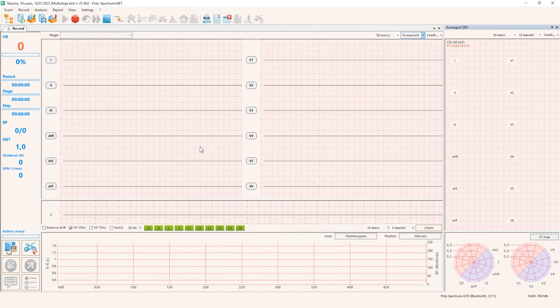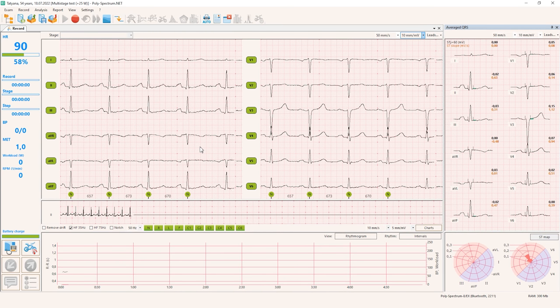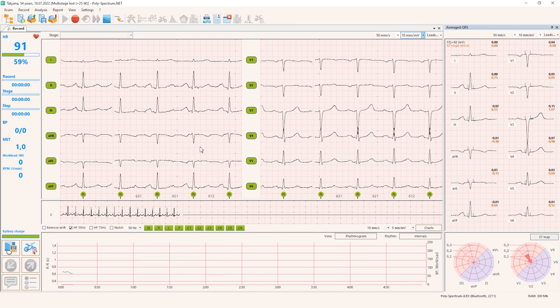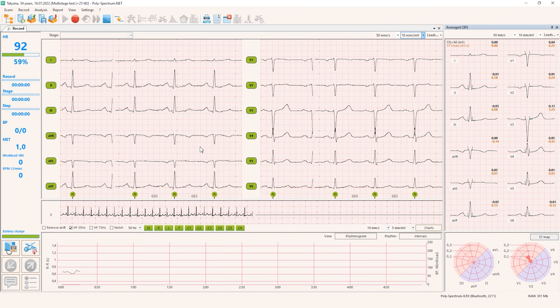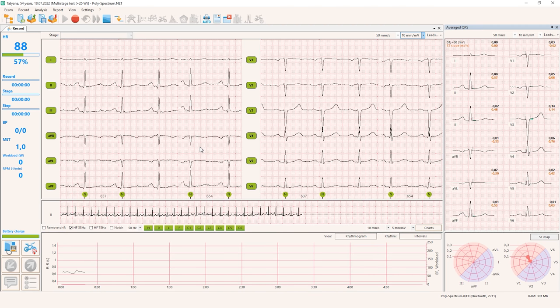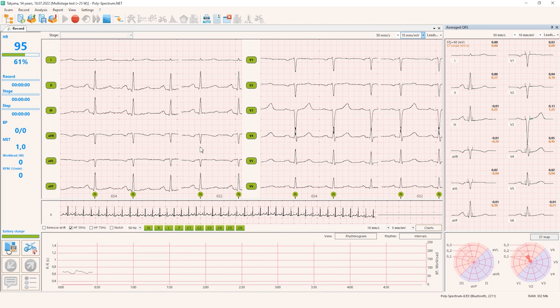Okay, now I'm ready to start monitoring. This is a software regimen that provides you the ability to view the ECG without actually starting the exercise protocol and without saving any data on the hard disk. So what is it for? To check ECG quality, to check the electrode placement, and also to check additional contraindications to the test.